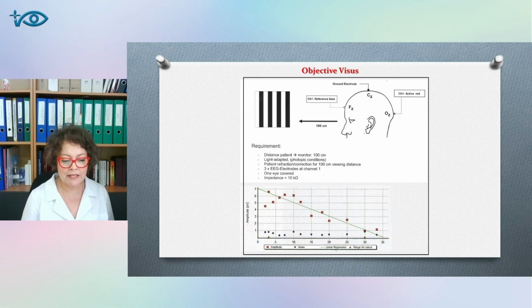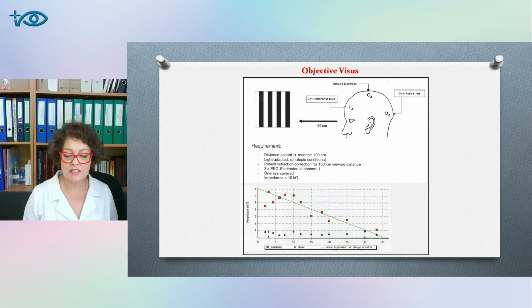The program allows us to evaluate the expected visual acuity by mathematical calculations by presenting black and white vertical stripes on the screen, gradually decreasing in width, at a frequency of 7.5 Hz and with a contrast of 60%. The accuracy and reliability of the study depend on the correct fixation of the patient's gaze on the center of the screen where the stripes are moving. This method of cyclically changing the scale of a moving pattern allows us to get a numerical value corresponding to a certain visual acuity. On these graphs, you can see how the regression curve with the values of the relative amplitude of the bioelectrical response within their confidence intervals is separated from the noise curve.